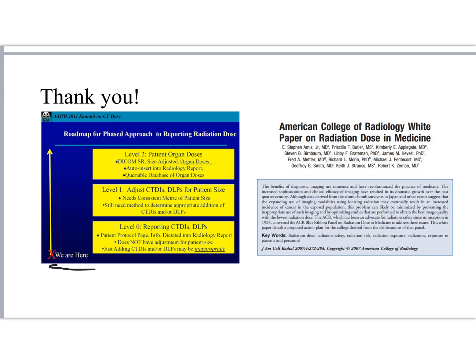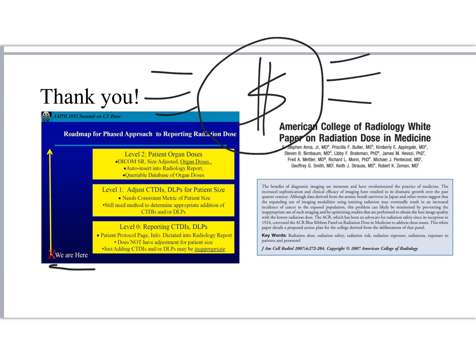I think one of the ways to think about that is how it ties into money. Because X-ray tubes, especially the ones that we use in CT, are expensive. Once managers understand that reporting dose can actually help us be more efficient in our use of the CT tube, because the tubes are expensive, and the electricity that we use to run the CT tube, then we might actually start to see ourselves move up this line here. But generally, we just talk about it in terms of risk, and the risk is so strange to try to quantify, like I've struggled to do throughout this lecture, that people just kind of lose it. So I mostly just talk about, hey, it will save us money to reduce patient dose and improve image quality. There's a great ACR white paper on this as well.